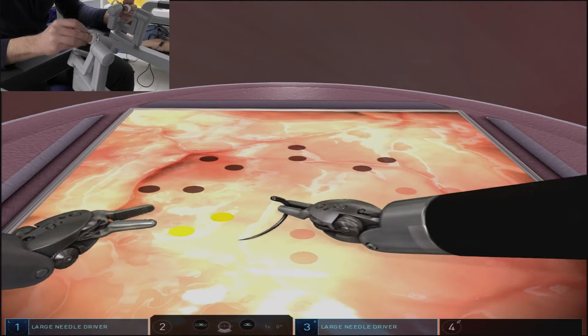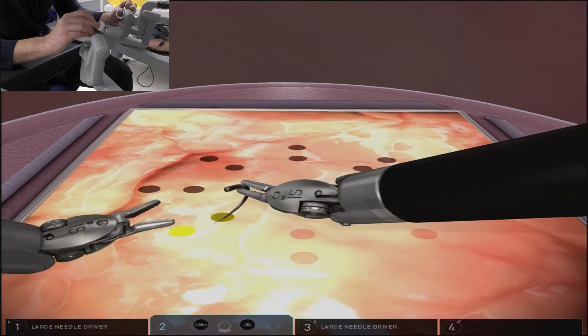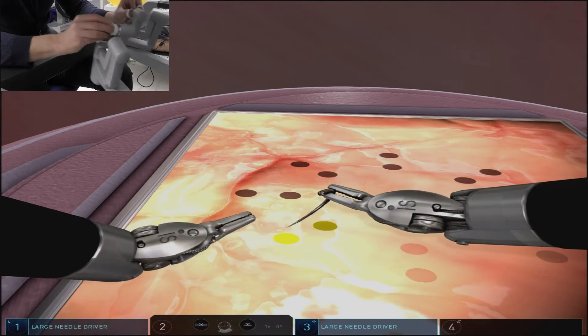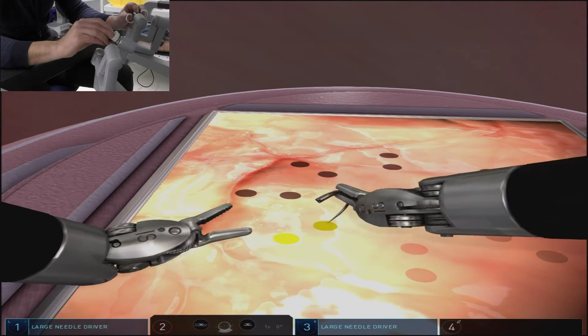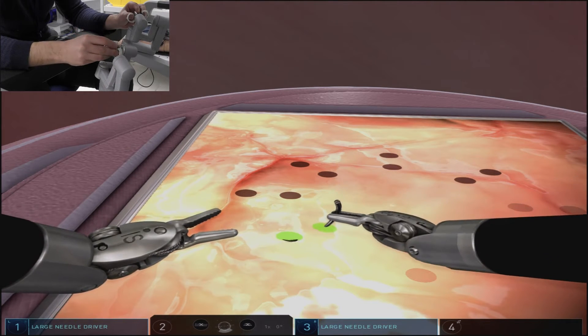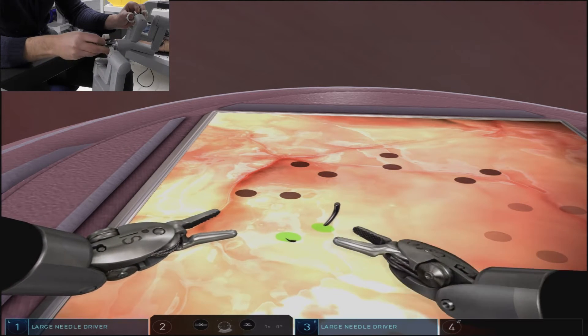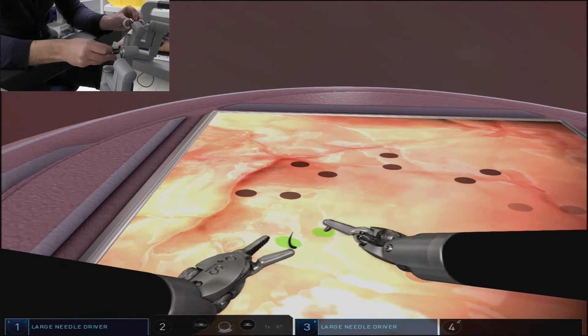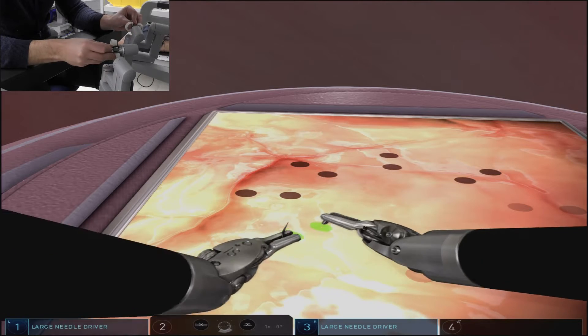For example, that last most inferior mid throw we used the left arm because it was an easy reload and the orientation worked with that range of motion from the left arm.